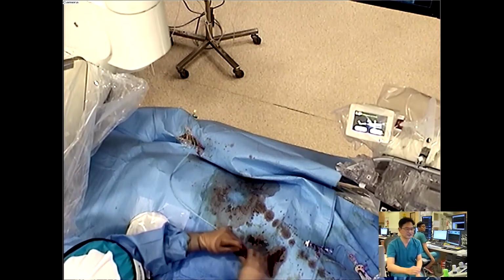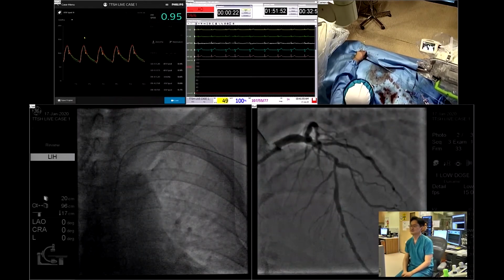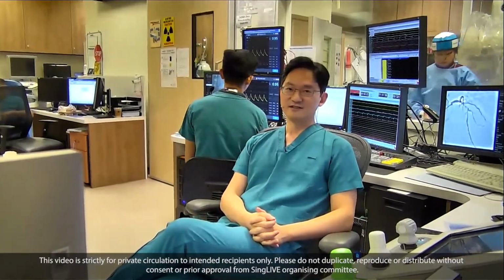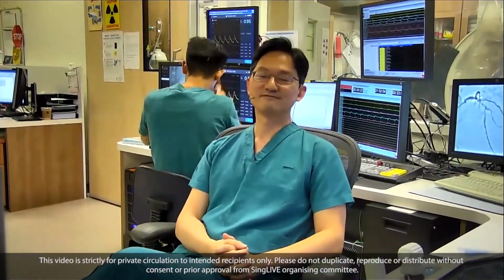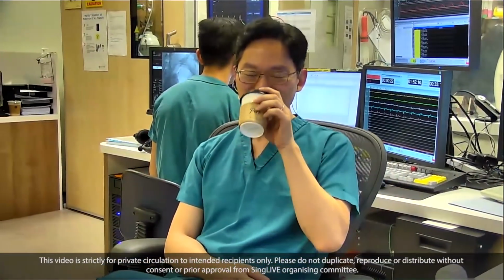Okay, so we're finishing the case now. Happy to take any questions. Okay. Paul, if I can ask, so very elegantly done case, very well demonstrated. I can see the advantage to the operator where there's no radiation, you're not wearing the lead jacket, enjoying your sips of coffee. What was the advantage here for the patient in this case?